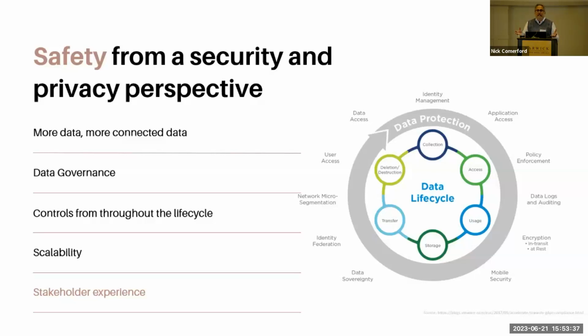So anytime you build this ecosystem that has patient data, you also have to build in all of these tools that can monitor who accessed the system when, what did you do with the patient data, was it deleted when you had to delete it? If you get a request from an EU patient to delete it, how do you confirm you deleted that data? So there are all of these requirements for things you have to monitor on an ongoing basis, as long as you have your app and even years after you have that app.